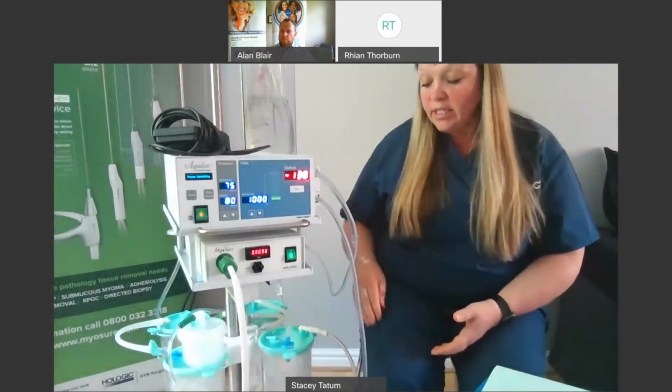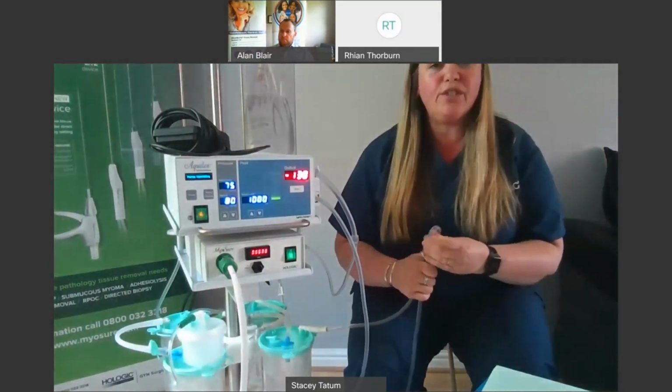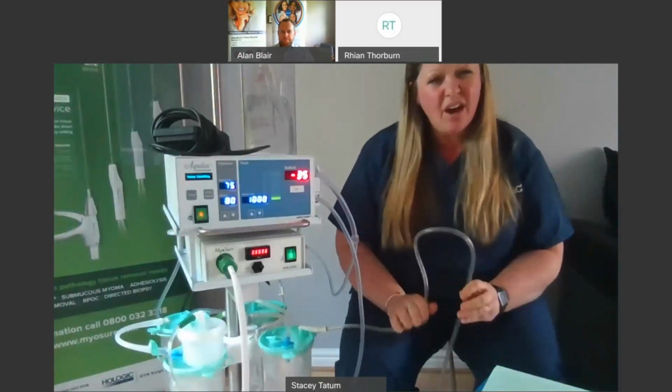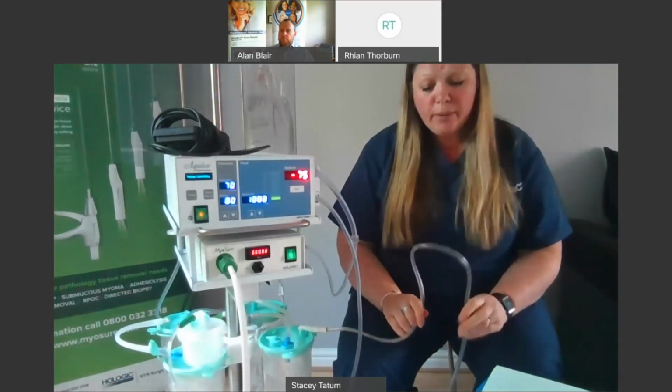So once I've checked the canisters, I'd start to check the yellow tubing. Make sure the surgeon hasn't rolled over it. They're not standing on it. There's no kink in it. Make sure we haven't hung this over the patient's legs. I know as nurses, we don't like things draping on the floor, but the yellow tubing does need a little bit of gravity to help.